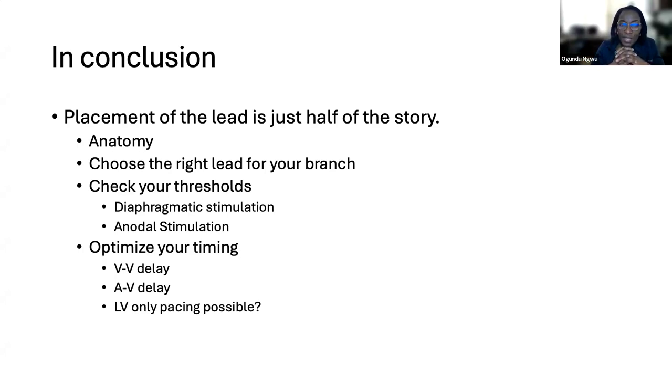I do think that if you have patients who have irregular rhythms like AFib, even if they don't have RVR, you have to take into consideration trigger pacing. So I do use that as part of my overall BiV pacing percentage. I do use trigger pacing as well.